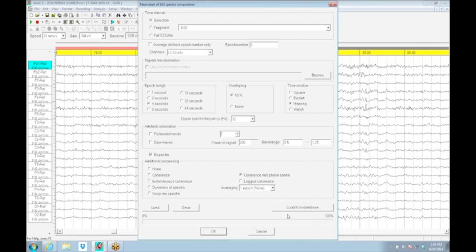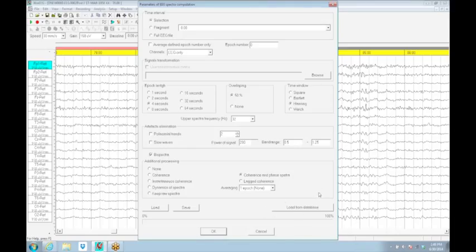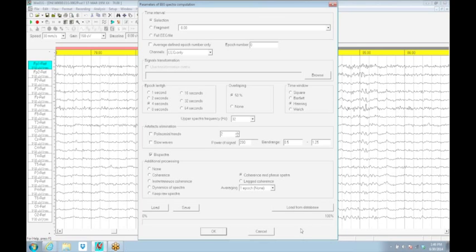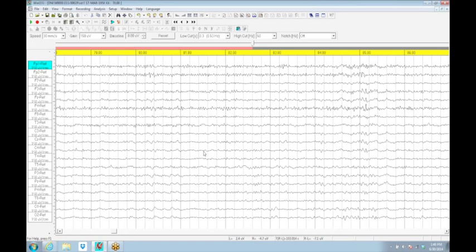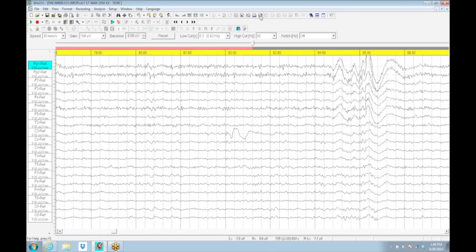If you do have the dongle and you go to your EEG spectrum here, you can end up getting norms from the database as well. There's an expense associated with that at this point, so it's not something, and unless you've got a dongle, this won't be lit up. That gives you a real quick run through on some of the simple processing.